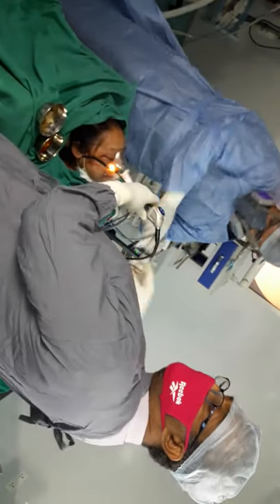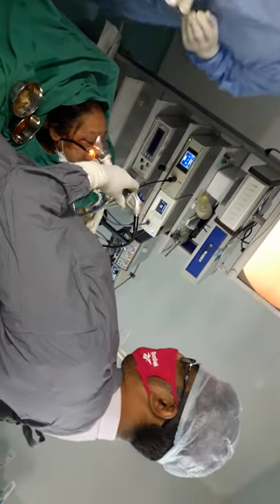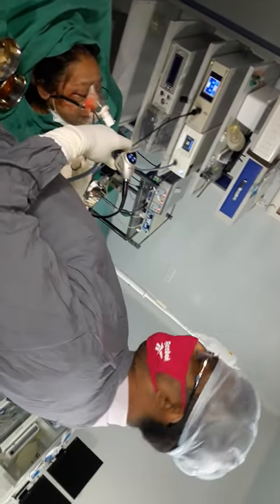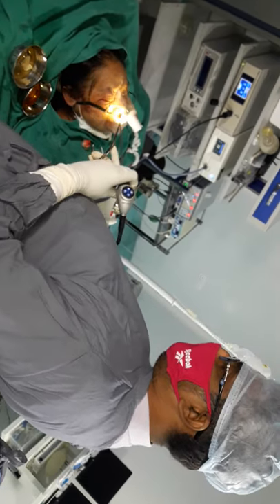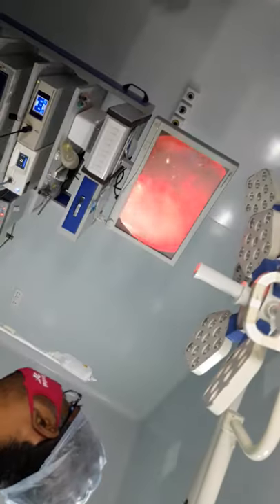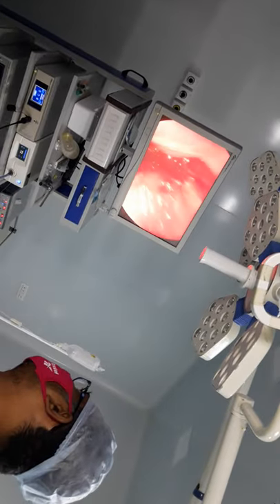This patient is from India with saturation of 77. This is Mucormycosis in a post-Covid patient. We have kept the face mask and made a small hole in the plastic, and through that I kept the camera and instrument and I am dissecting the Mucormycosis.